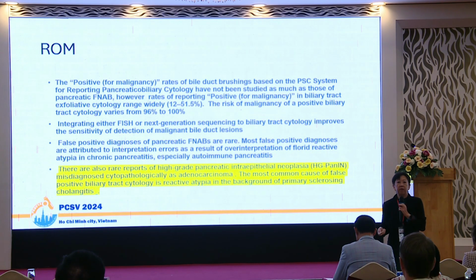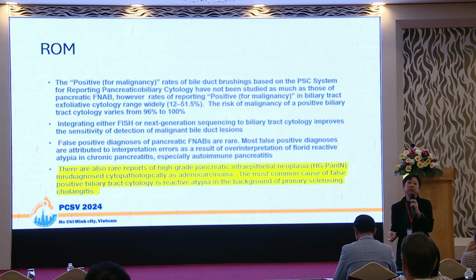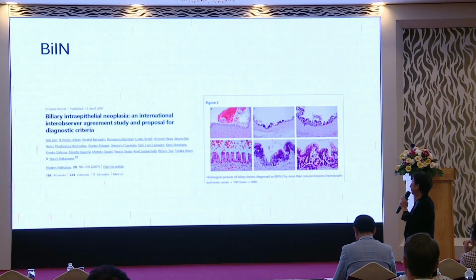We perhaps should have called it severely atypical rather than be so confident that it was adenocarcinoma, especially papillary, and other samples from the same patient, which we couldn't call. So this is non-virgin territory, you have to be careful about it, however confident you are at that time.